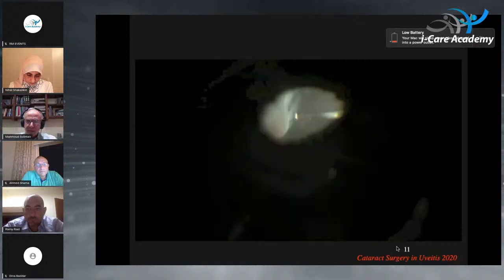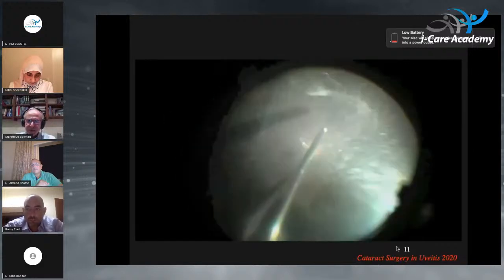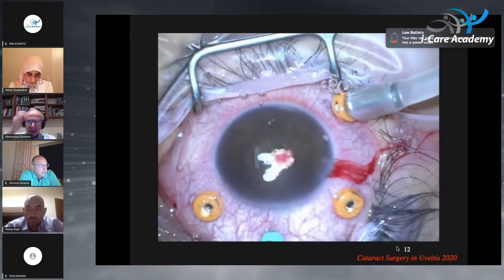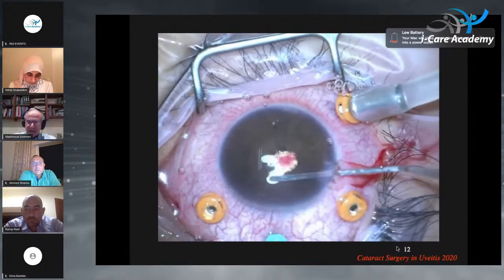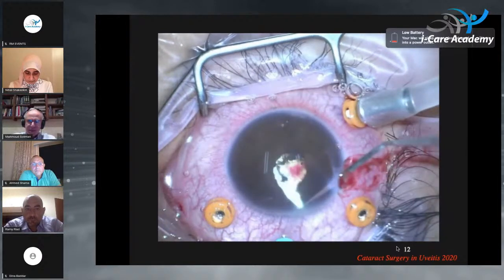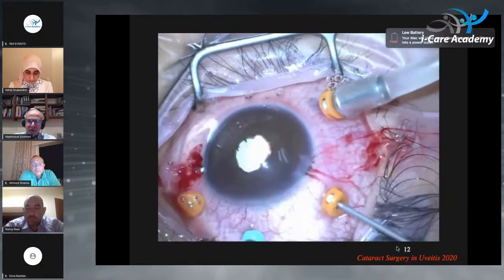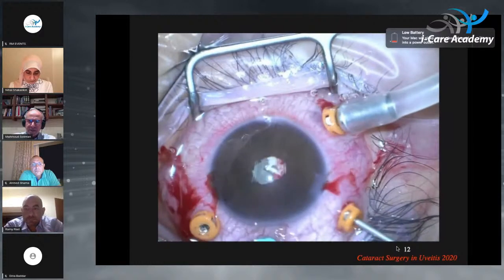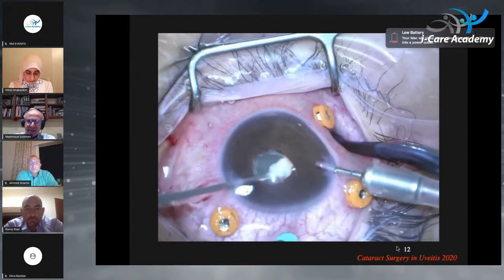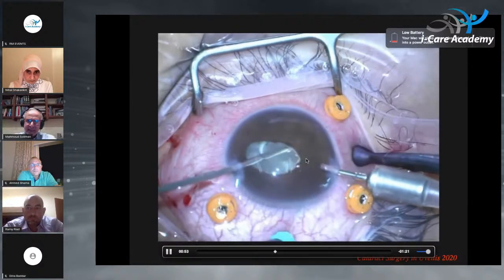In particular patients, you leave the patient aphakic, prescribe glasses, and they do quite well. Another patient here, this is a patient with anterior segment granuloma, which has taken place in the lens and in the ciliary body, which is a strange place. Again, the anterior segment is disrupted. I really cannot do a phaco, so you need to go in a combination of anterior and then posterior approach. You might have some bleeding because of the granulation tissue. As you see here, there is a granuloma occupying the lens and the ciliary body.